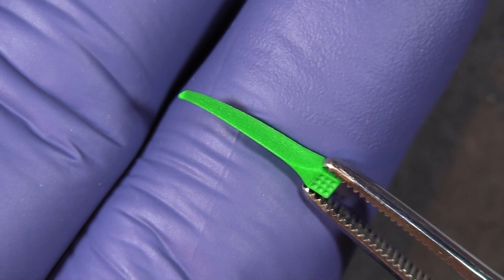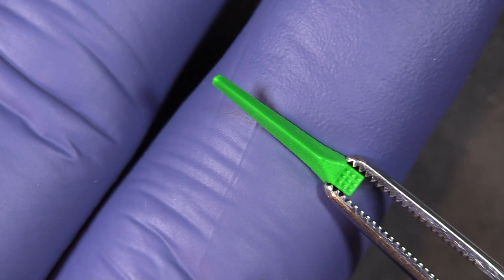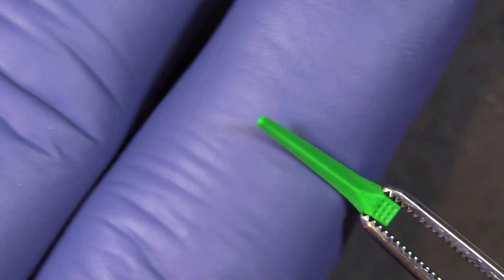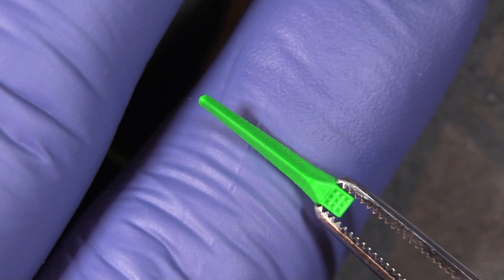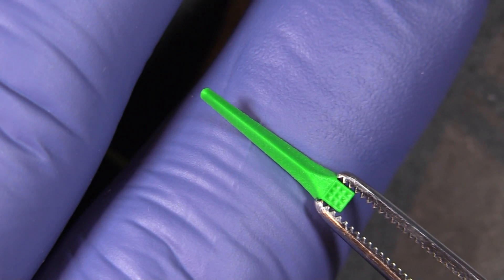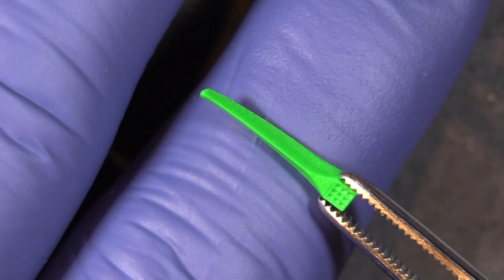One thing you may notice is that the sides of the wedge are textured, and that's to help prevent the wedge from backing out after it's been inserted. That's also why they're a little bit longer than traditional wedges. That more gradual taper helps the wedge to not get forced back out of the interproximal space.